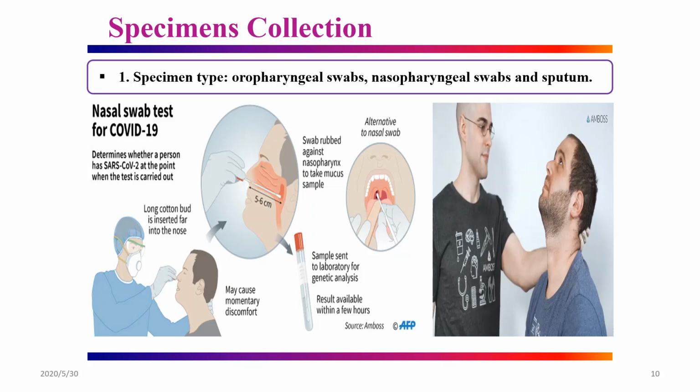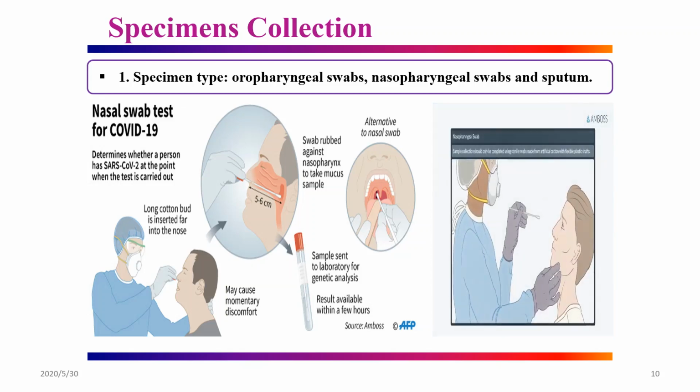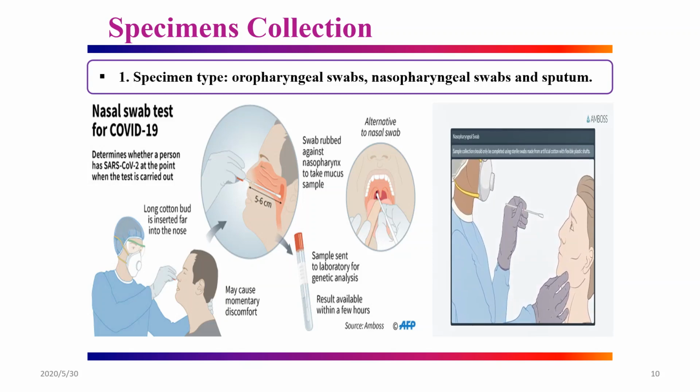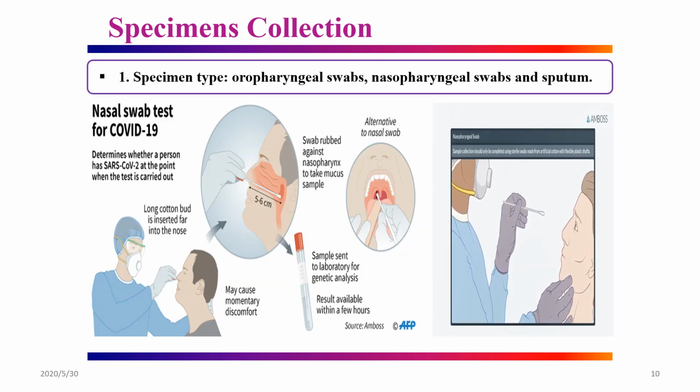Be sure to advise the patient of potential discomfort during sample collection and let the patient know that they are welcome to close their eyes. Sample collection should only be completed using sterile swabs made from artificial cotton with flexible plastic shafts.